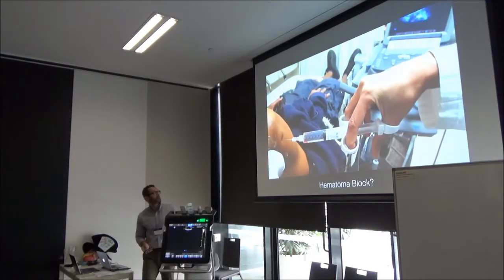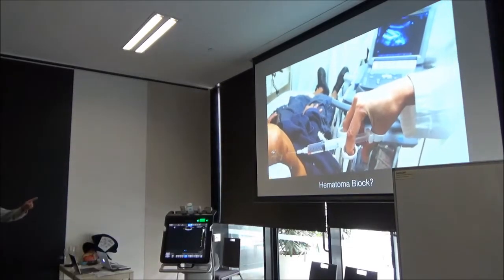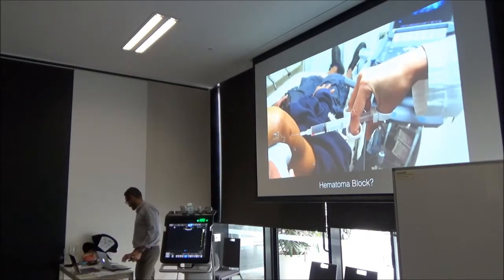Then she pushes in. So that's a hematoma block, essentially. Right? And that's what you generally don't do when you're doing shoulders, is look for that hematoma. You can see it up here.